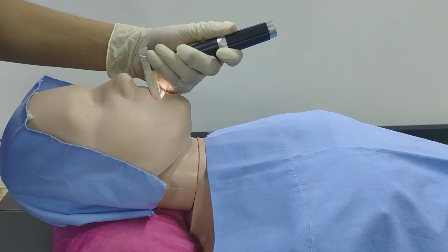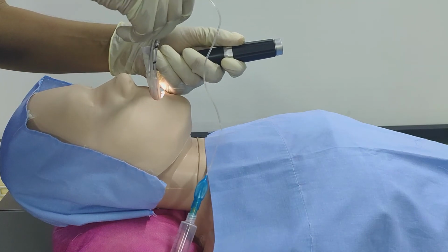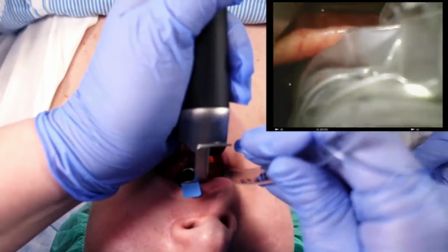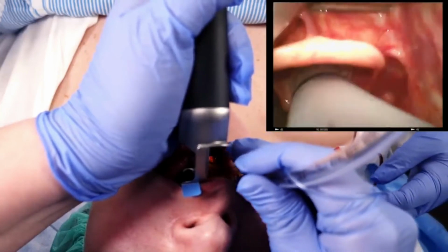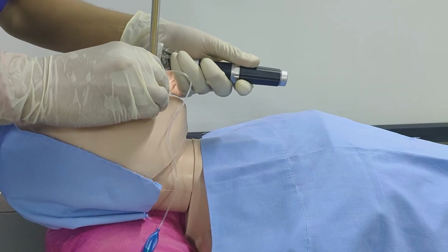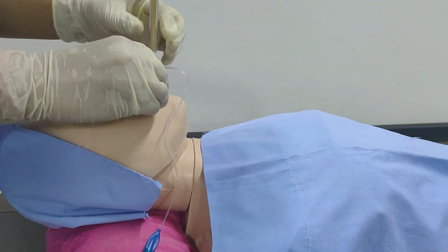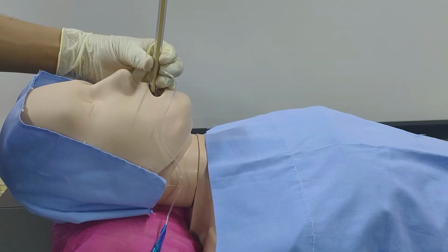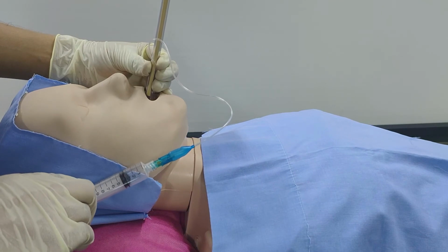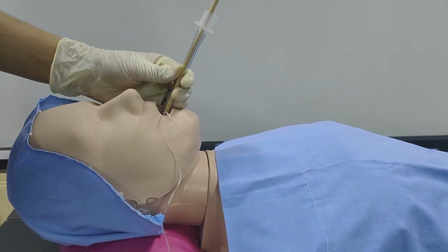Hold the ET tube in your right hand with a pencil grip. Insert the ET tube through the right corner of the mouth towards the glottic opening. Advance it further until the cuff is about 3 to 4 cm beyond the vocal cords. Remove the laryngoscope. Secure the placement of the ET tube by inflating the cuff with 10 cc of air using a syringe. Once done, the stylet can be removed.